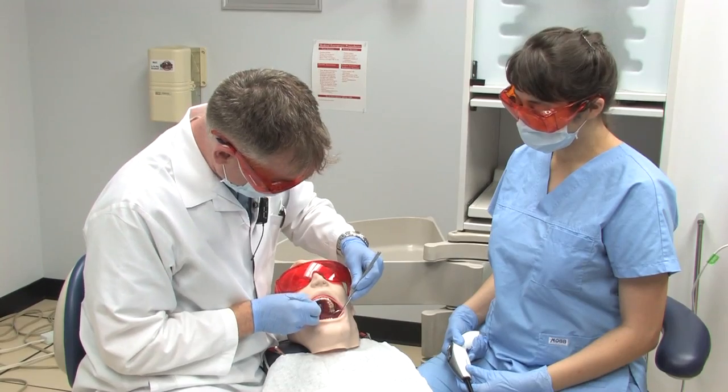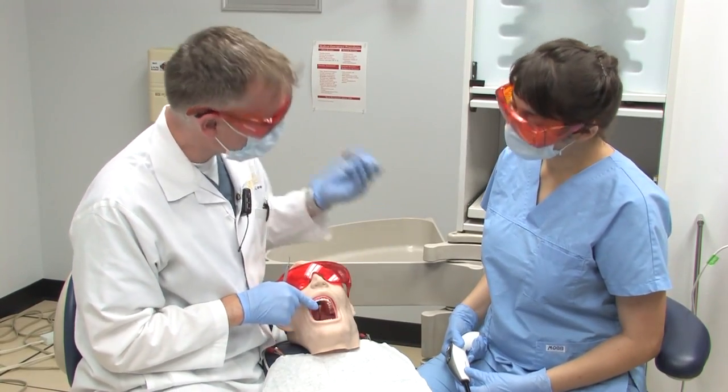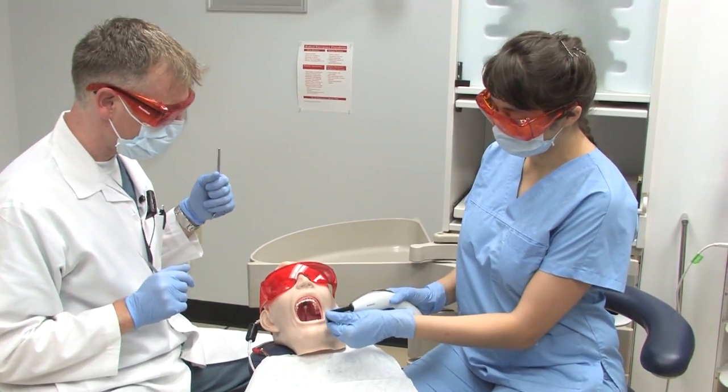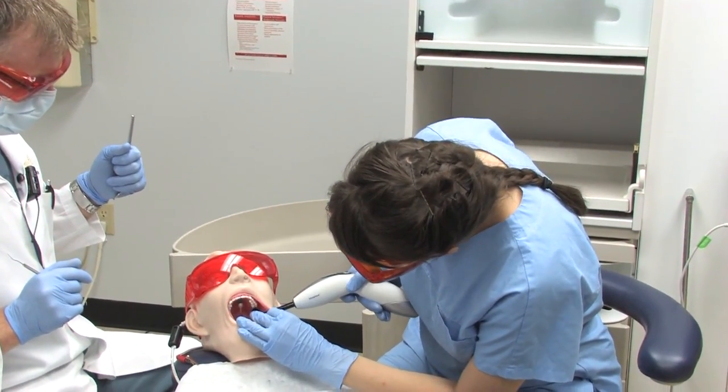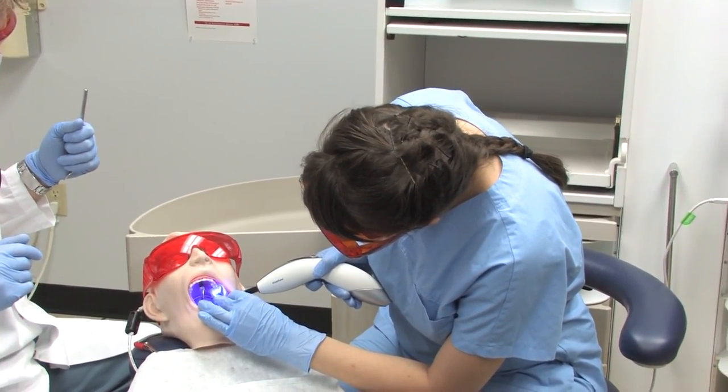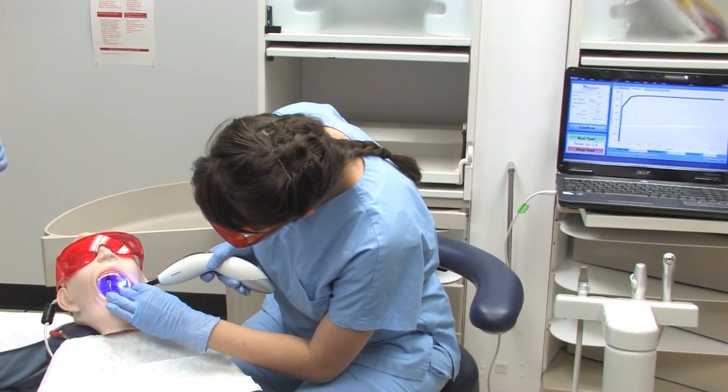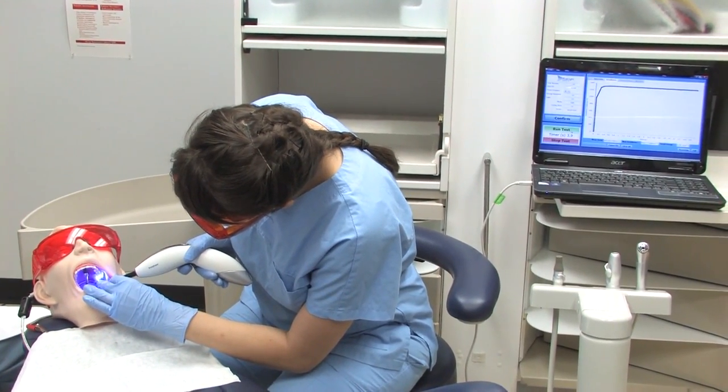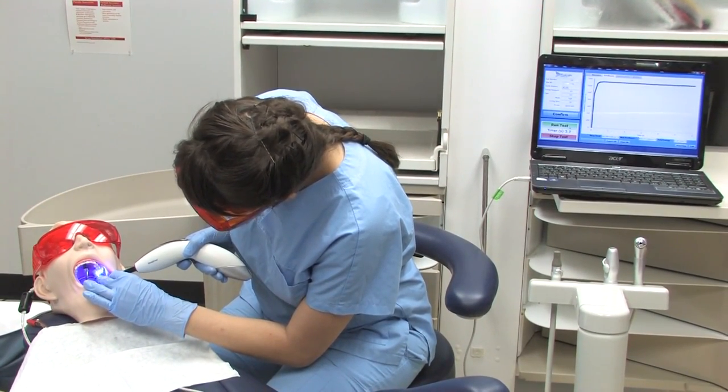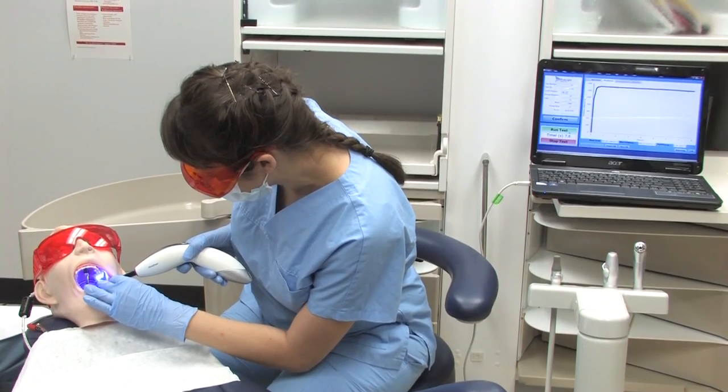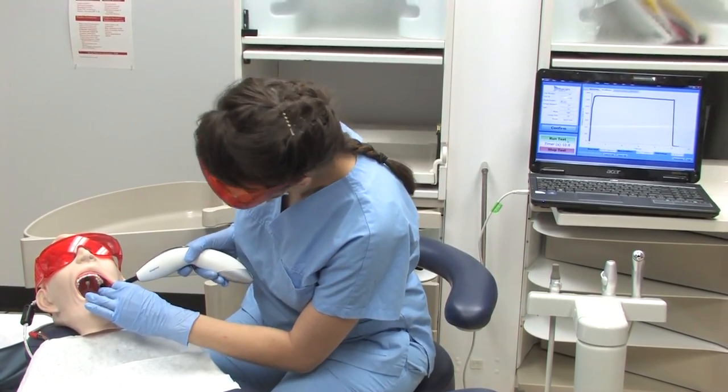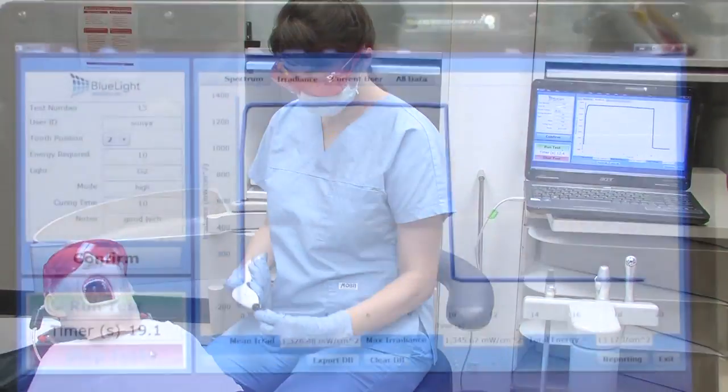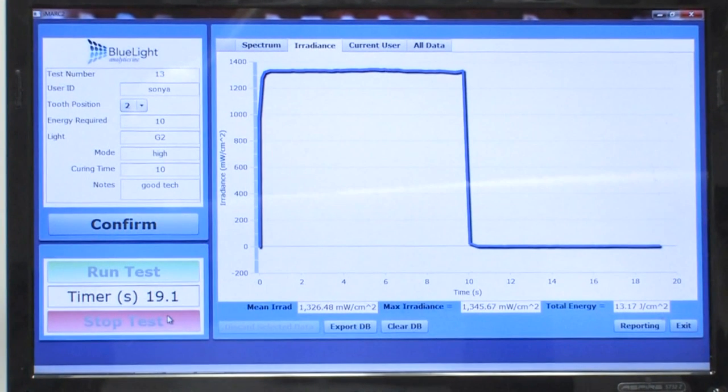Okay, Sonia, please cure tooth number 27. As you can see, she was really focusing on her technique, and she delivered 13.2 joules per centimeter squared of energy.